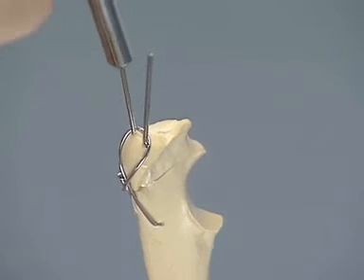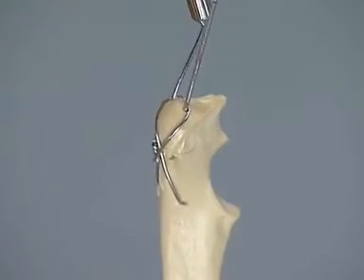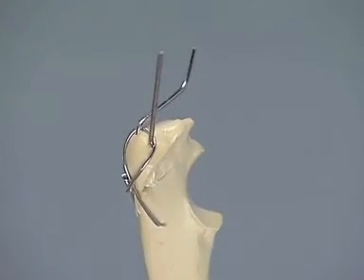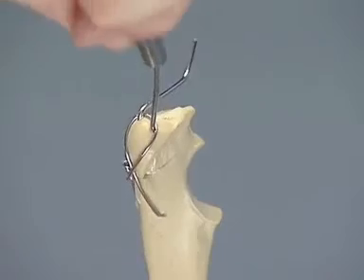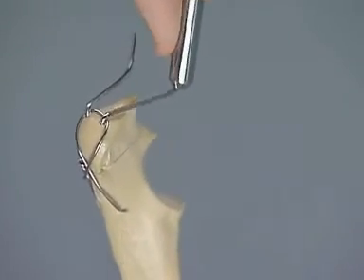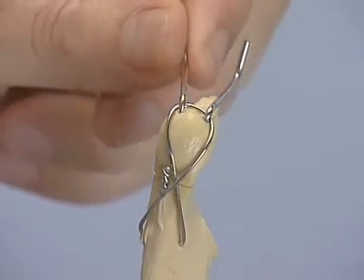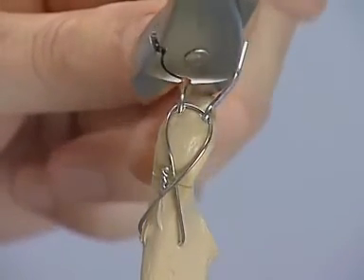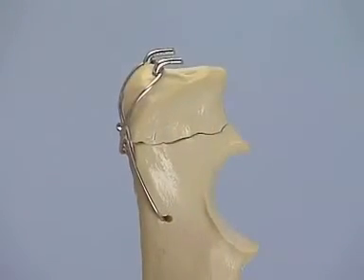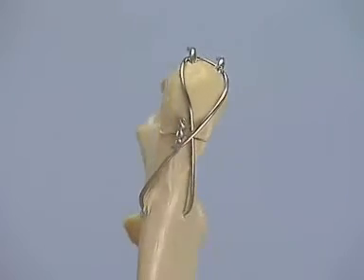Bend the K-wires at right angles with the bending iron, then bend and cut the excess off with the wire cutter. Activate the tension band.